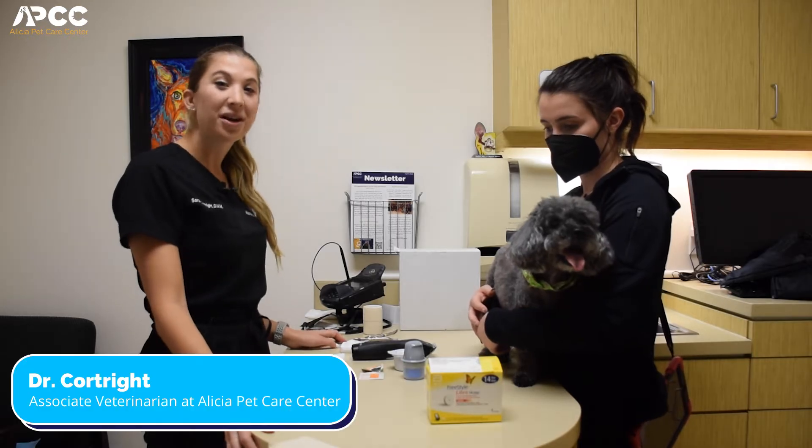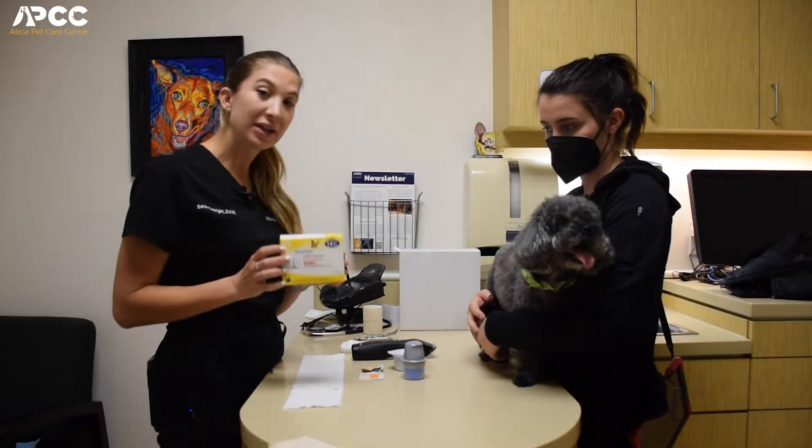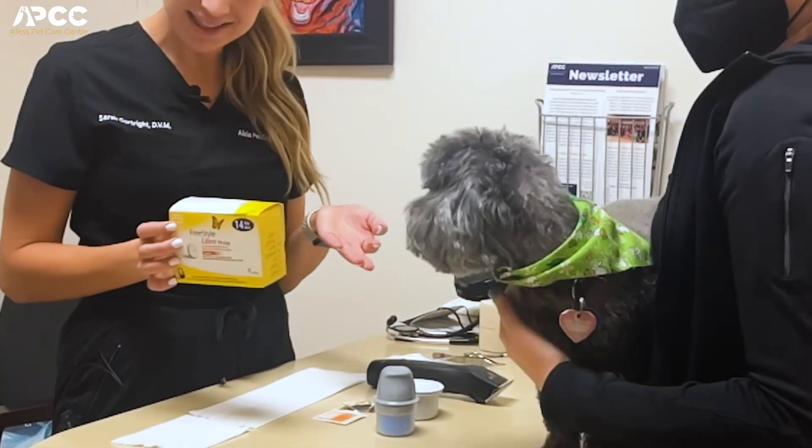Hi, I'm Dr. Courtright and we are coming to you from Alisha Pet Care Center. Today we are placing a Freestyle Libre on our little patient, Sadie.